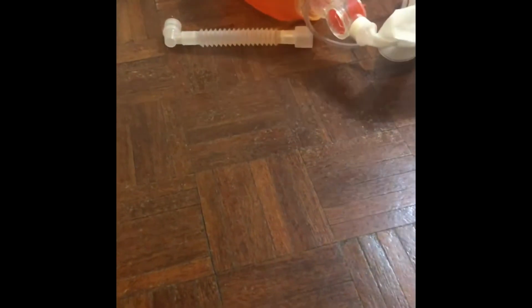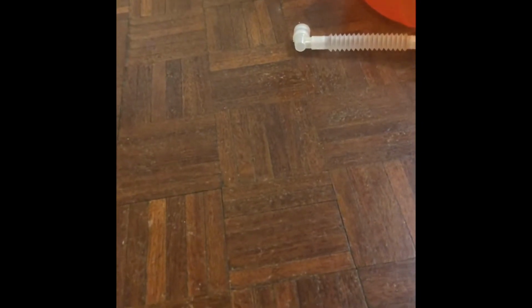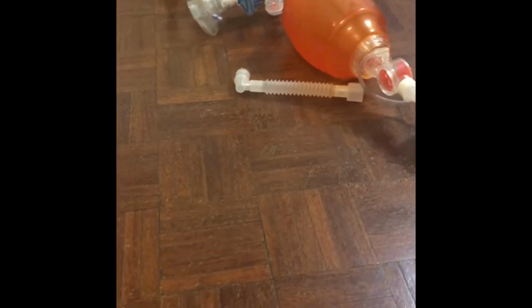Right there, you might not be able to see them. We're going to have a size smaller just in case the one we assumed is going to fit doesn't. We're going to use a gum elastic bougie, also right there. We're going to use this to pass through the vocal folds during laryngoscopy to feed the tube over. So we're going to try to avoid using the stylet as they can dislodge the tube when they are removed.